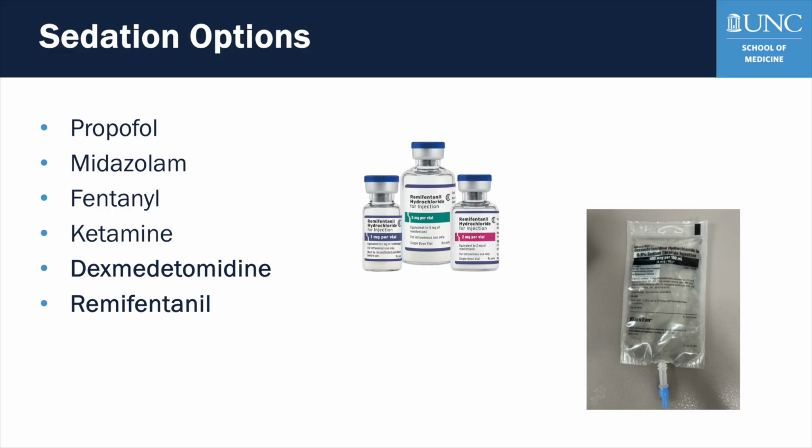Next, we select sedation that keeps the patient calm but still breathing and cooperative. Medications like propofol, midazolam, fentanyl, and ketamine are familiar and widely used, but the literature associates them with less ideal intubating conditions and more frequent adverse events when used as primary agents for awake intubation. High-quality evidence strongly supports dexmedetomidine and remifentanil for awake fiberoptic intubation. Together, they provide cooperative sedation, excellent conditions for airway instrumentation, and minimal respiratory depression.